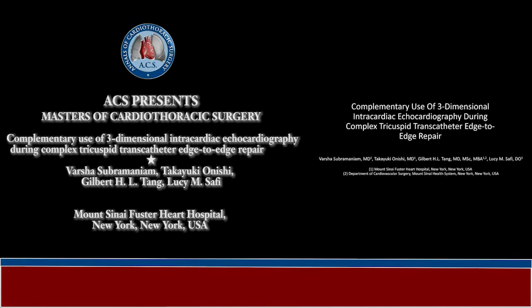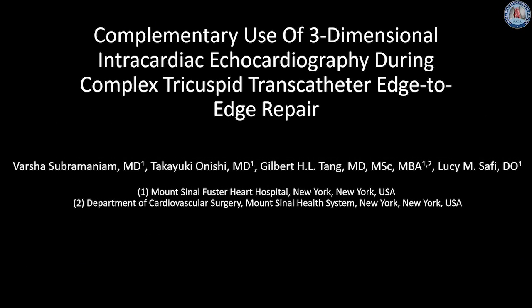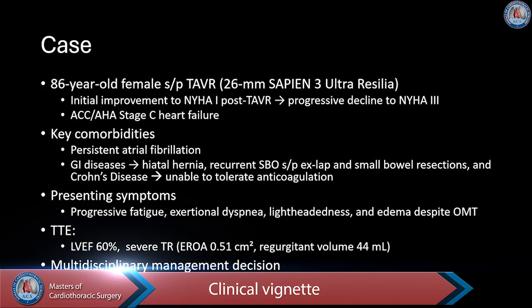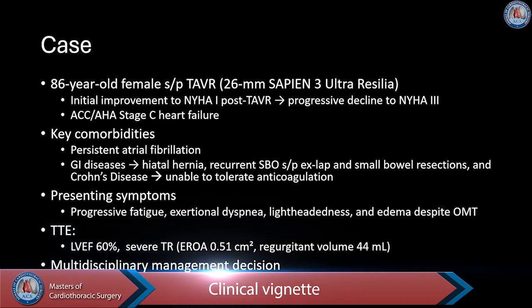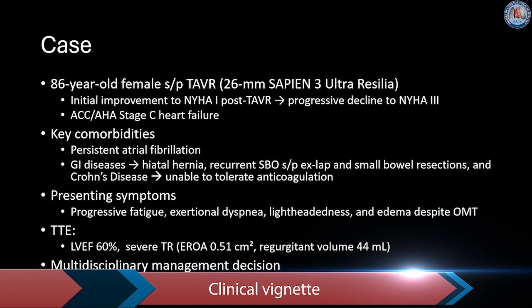In this video, we present a case of complementary use of three-dimensional intracardiac echocardiography during complex tricuspid transcatheter edge-to-edge repair. Our case begins with an 86-year-old female with severe aortic stenosis, status post-transcatheter aortic valve replacement.